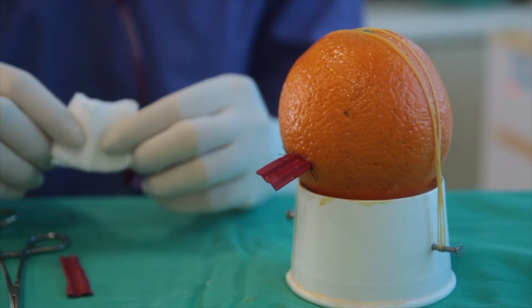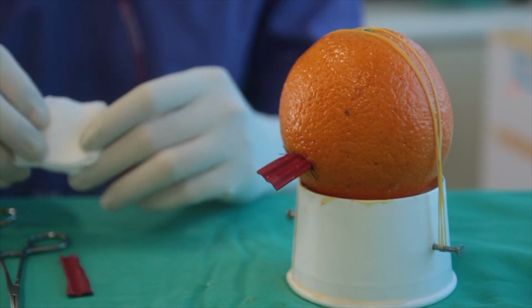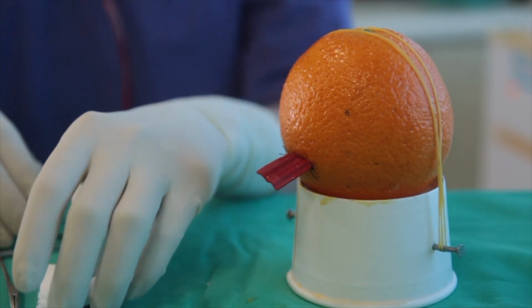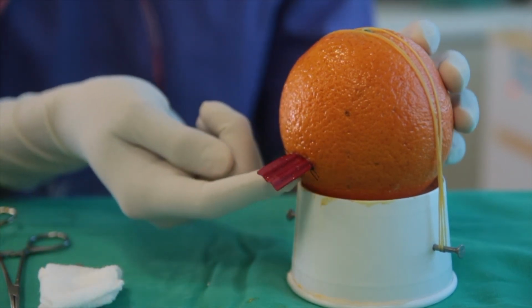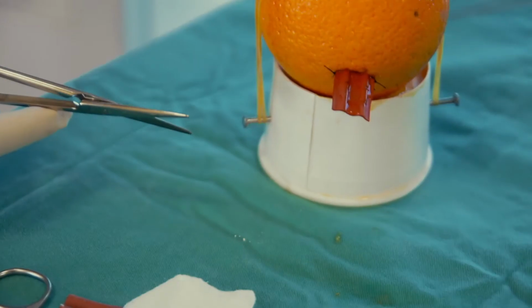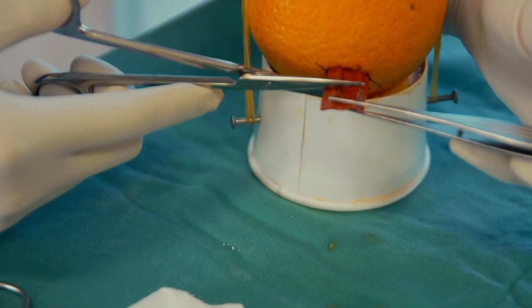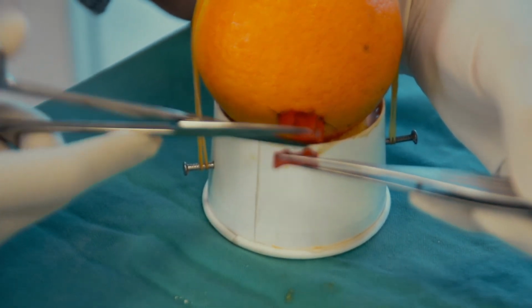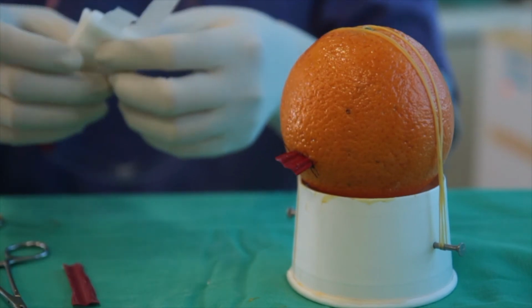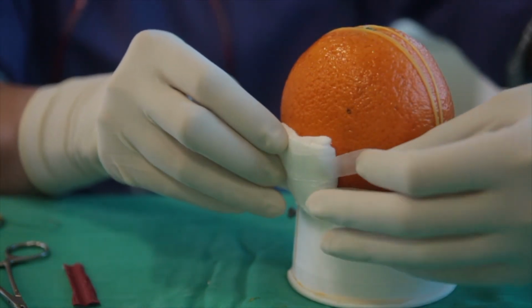Lastly, we're going to put some gauze dressing on top of the drain. If you think the drain is too long, you can always use the scissors to cut it off. Then you can apply dressing.